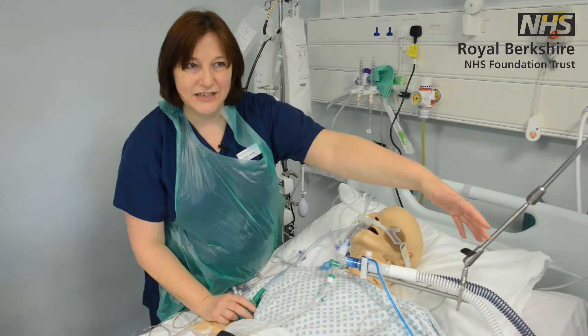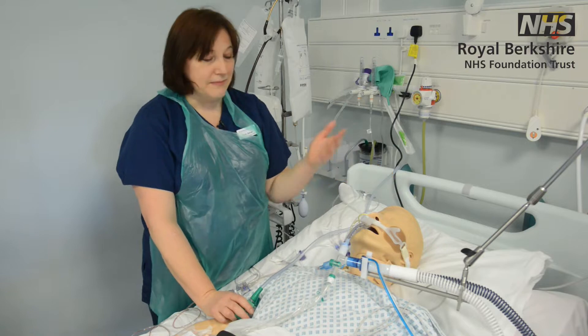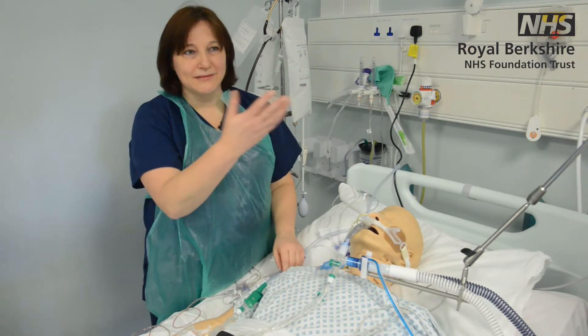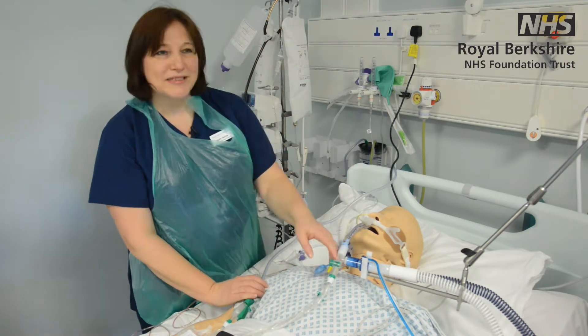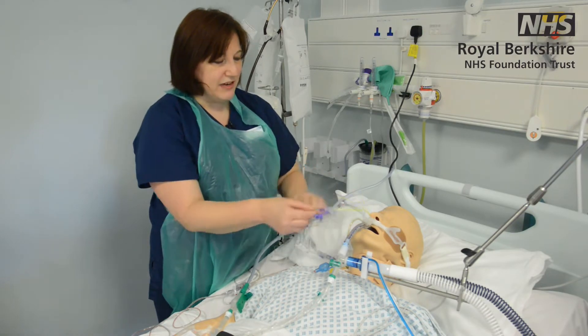You'll also see ventilator tubing attached to the vent. The ventilators change from unit to unit — we all use slightly different makes across the NHS. Something else you'll see on the face of the patient is a nasogastric tube.